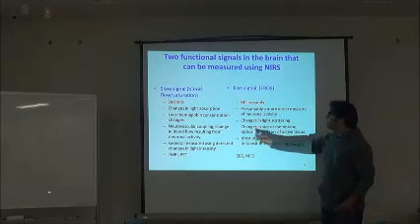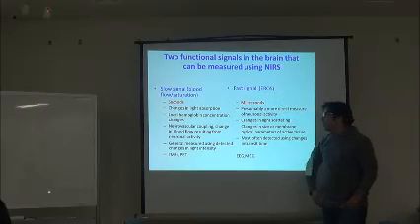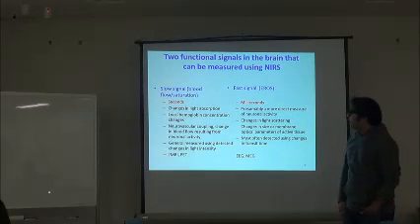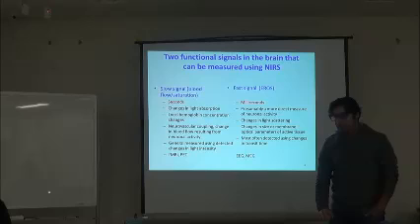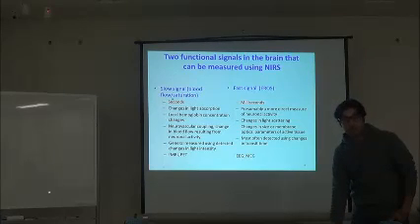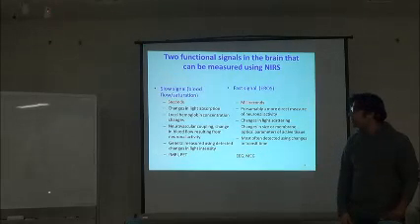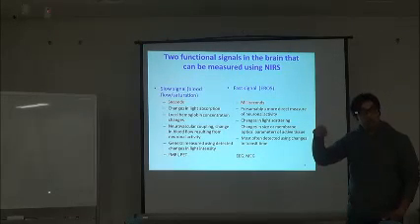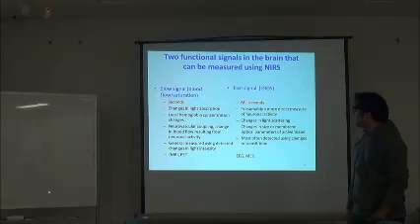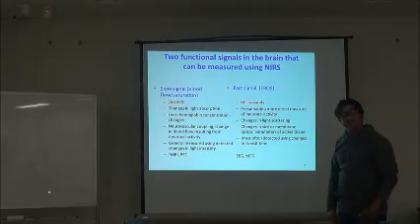And the other one is the fast signal, also called the event-related optical signal, EROS. As you saw already, the slow signal takes two seconds to respond, and then it takes around 5 seconds to go to its peak value, so it's quite slow. But the fast optical signal goes in the milliseconds.